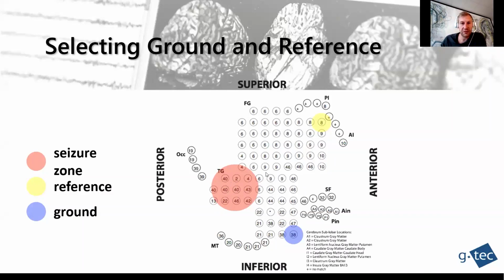So here we have to be very careful, and if this polarization voltage is very high, then the amplifier can saturate. There are a few ways to mitigate that. One is, for example, by adding the switching unit or an analog high pass, we can remove the DC drift or the polarization voltage, the DC offset, and by that have a zero mean signal again. And with that signal, we cannot saturate the amplifier again, at least from the ground electrode.